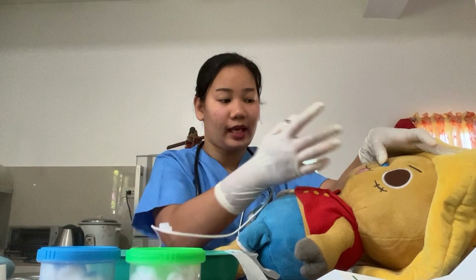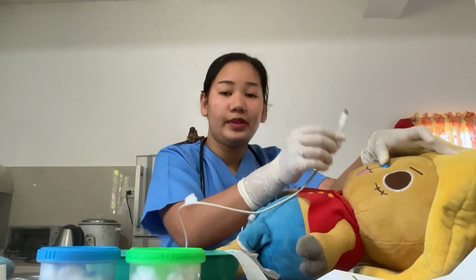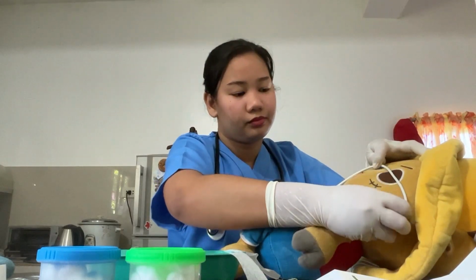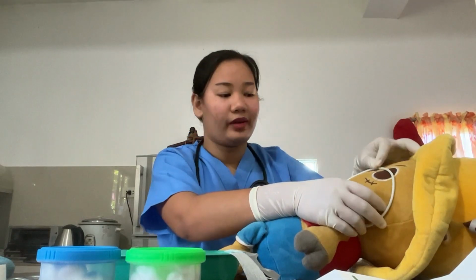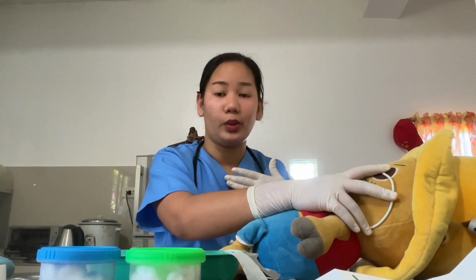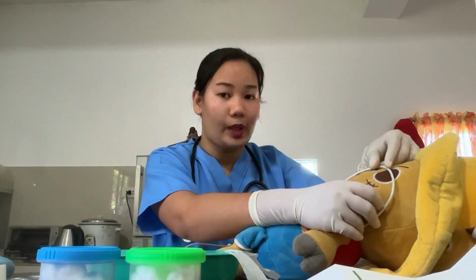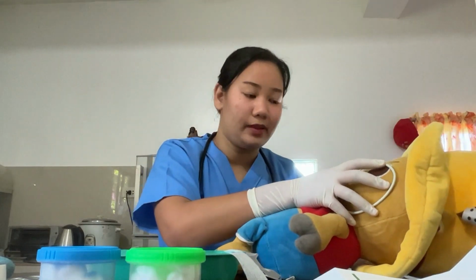And since I observed that this side has the greater airflow, I will now pass the tube. Gently pass the tube. So once the tube has reached the pharynx, I will ask the patient to swallow. Ma'am, you can swallow now. Okay, so the patient is able to swallow while I'm advancing my tube, and then I will slowly lower her head. Okay.